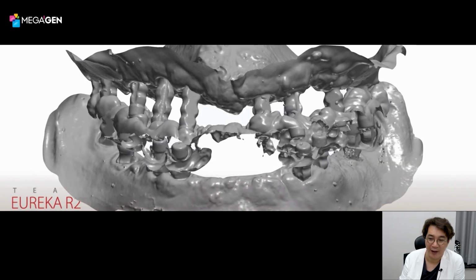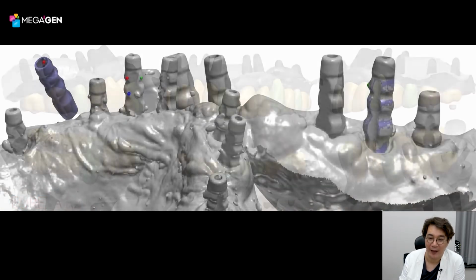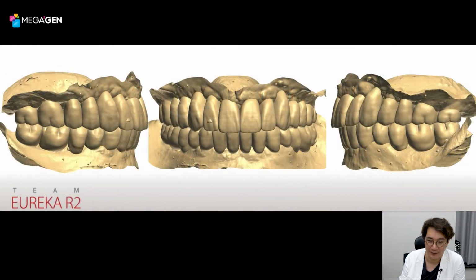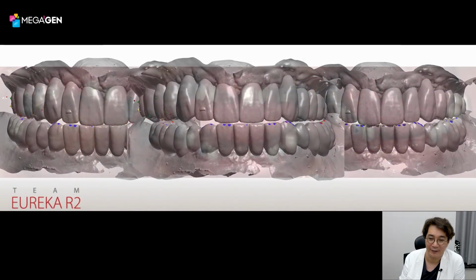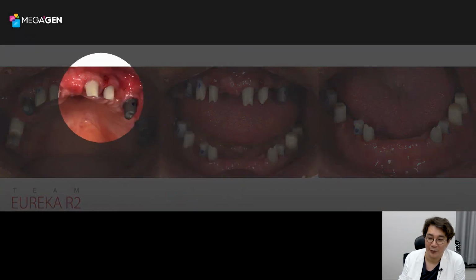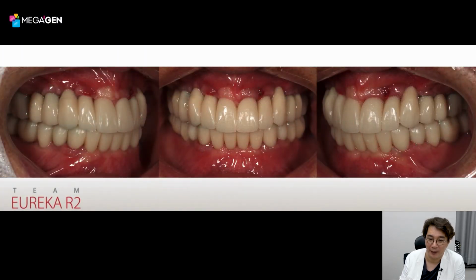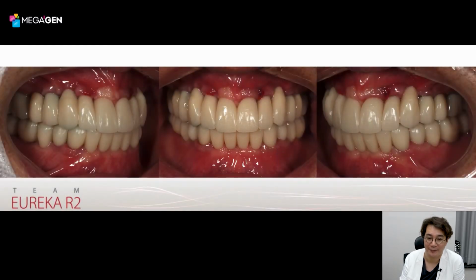So without stone pouring, I mount it and match the library, and after that, draw the provisional restoration and customize the abutment and put in a dynamic occlusion status, and then connect the provisional customized abutment and put in a PMMA crown. This is the modelless procedure. So not only an intraoral scanner can do the modelless, but also impression scan mode can do the modelless procedures.